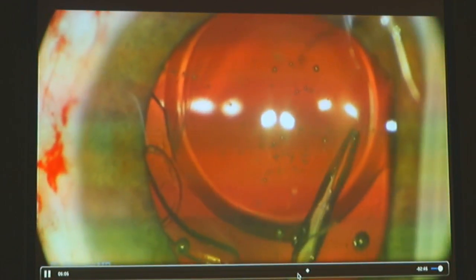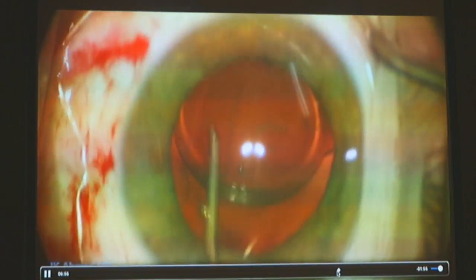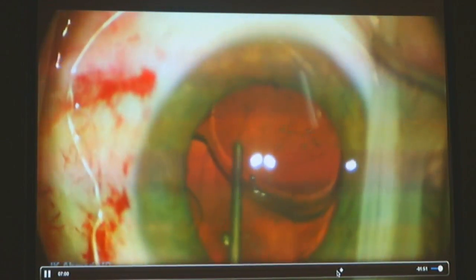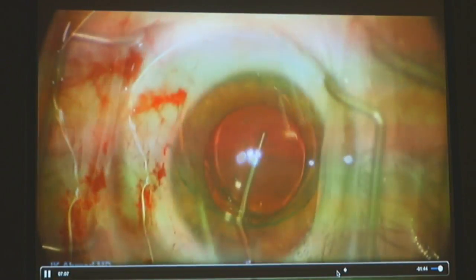And I do not feel a vitrectomy is needed. The reason is because I will do a posterior rhexis and I will push the optic through the posterior rhexis. So now there's nowhere for the cells to grow. There's no hyaloid for the cells to grow over top. There's no capsule for the cells to go over top. So the risk of this patient developing opacification is very low.